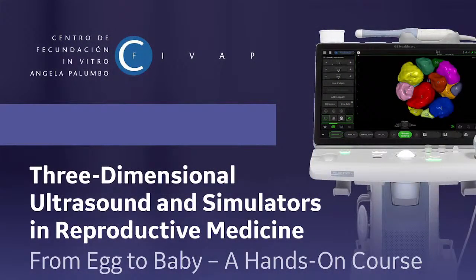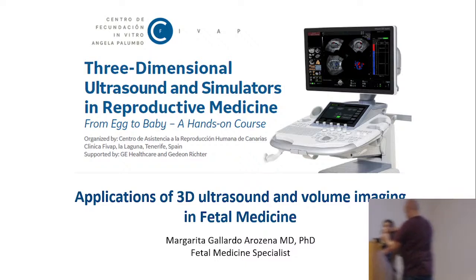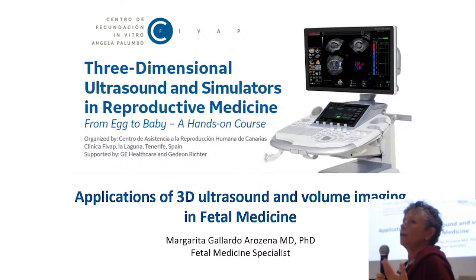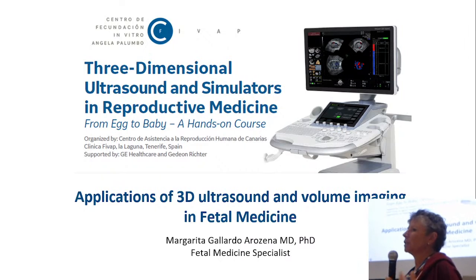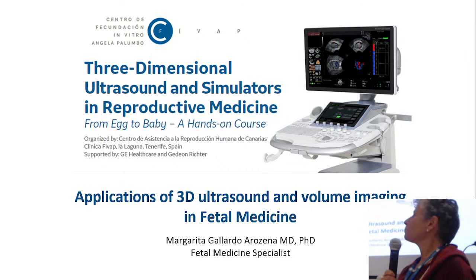But to do three, and to understand where it is really useful for a diagnosis. So I think this is a new and very interesting field also.